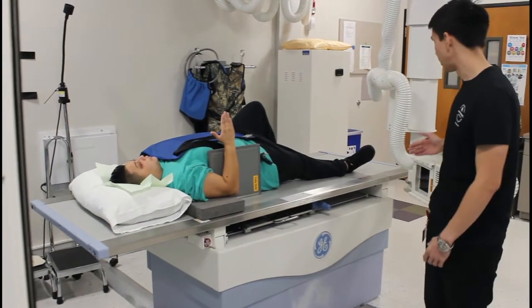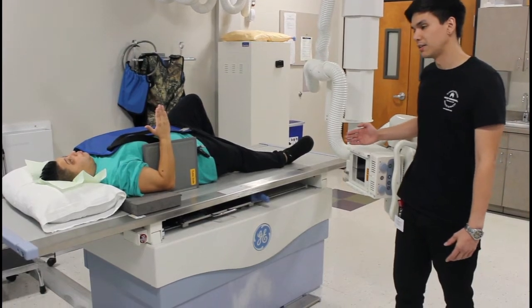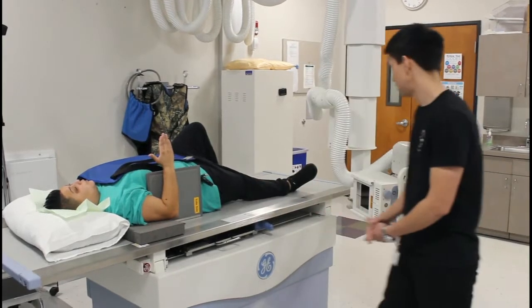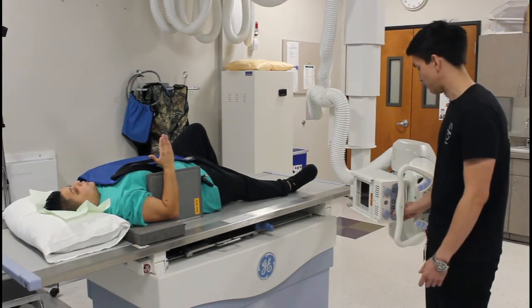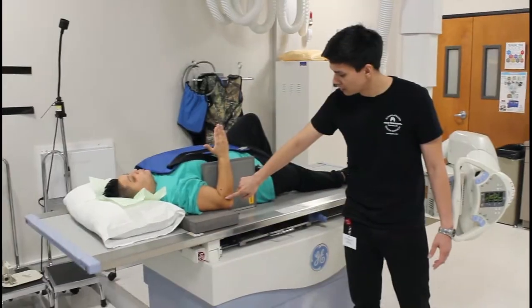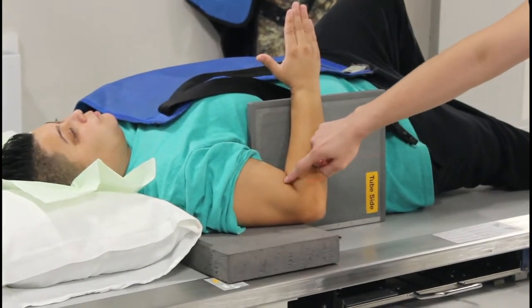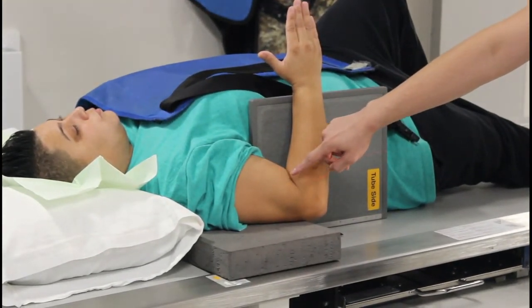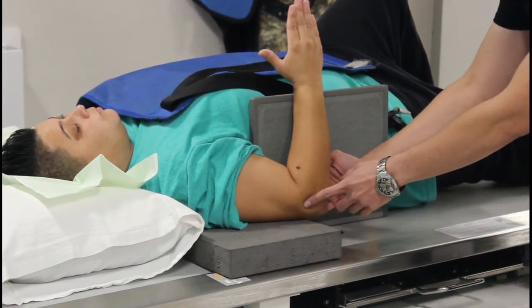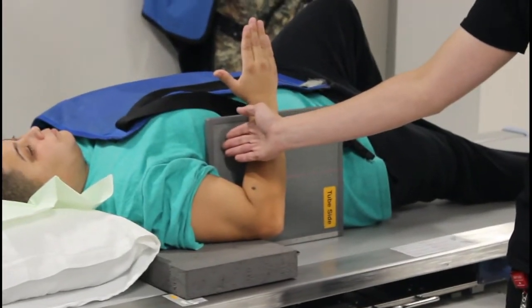alignment of the tube using a 45-degree cephalad angulation to elongate that radial head. So again, we are angled at the middle of the forearm elbow joint, just several inches in between from the olecranon process and the elbow joint crease. So you're using the epicondyles from the humerus to ensure that they are running perpendicular to the IR.